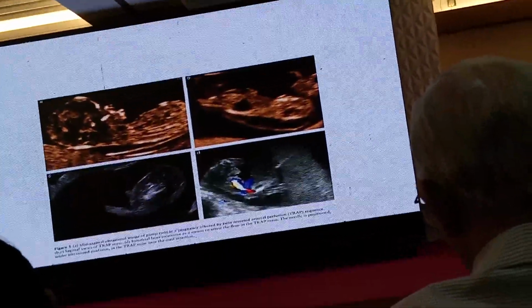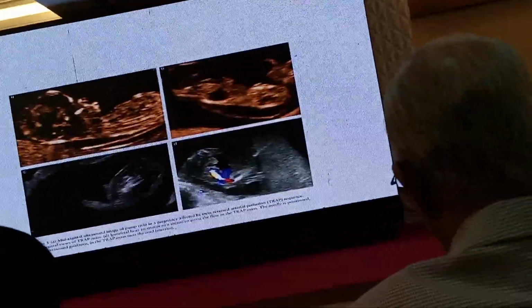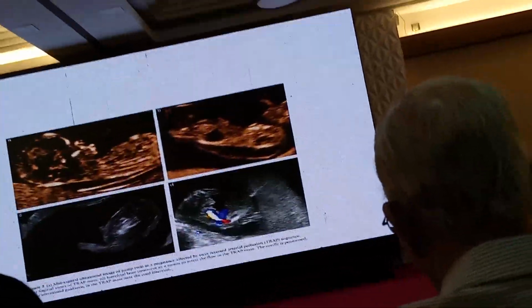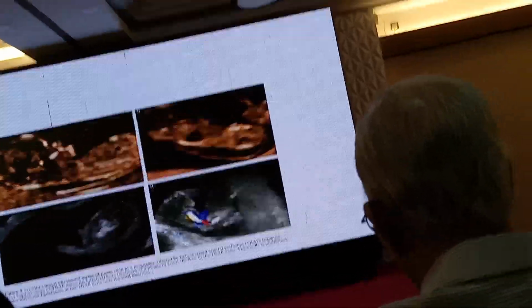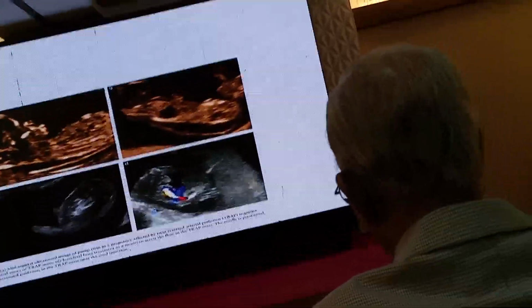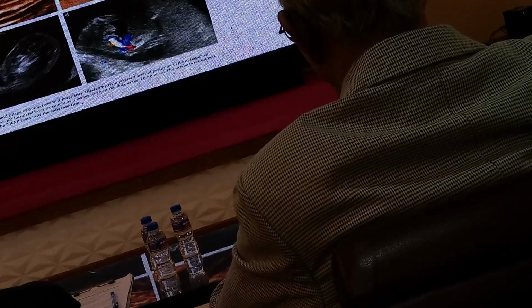Again, the same picture, but here, what I want to show you, there are criteria you can treat, there's certain criteria. And the prognostic, if the prognosis is poor, maybe you try to help by cutting the blood supply or these anastomosis from the amorphous twin or the recipient twin, and the donor, the pumping twin, might survive if you do either laser treatment ablating these anastomosis, or you do radio frequency, which is done by ultrasound treatment, or coagulation also.